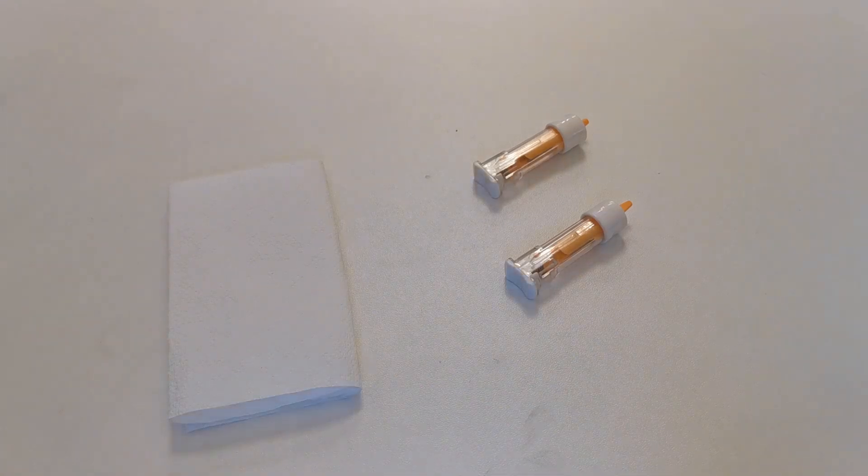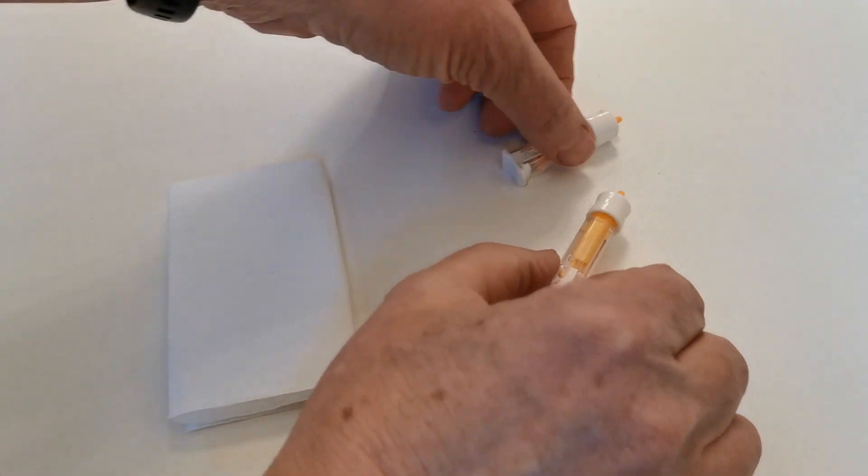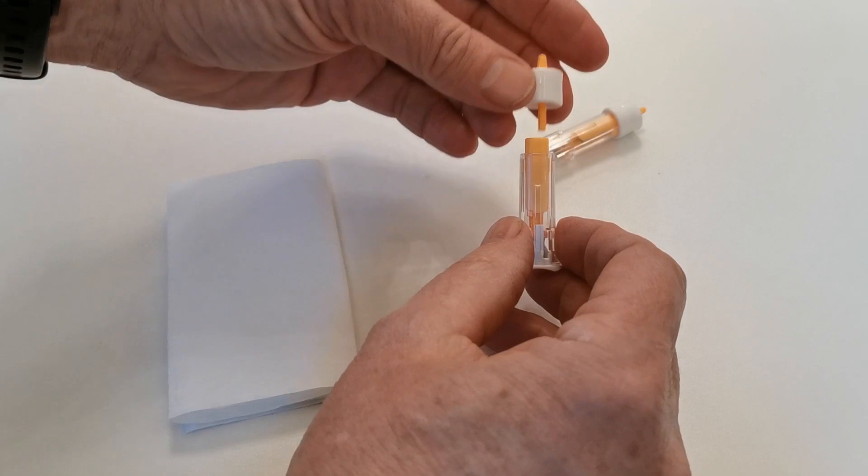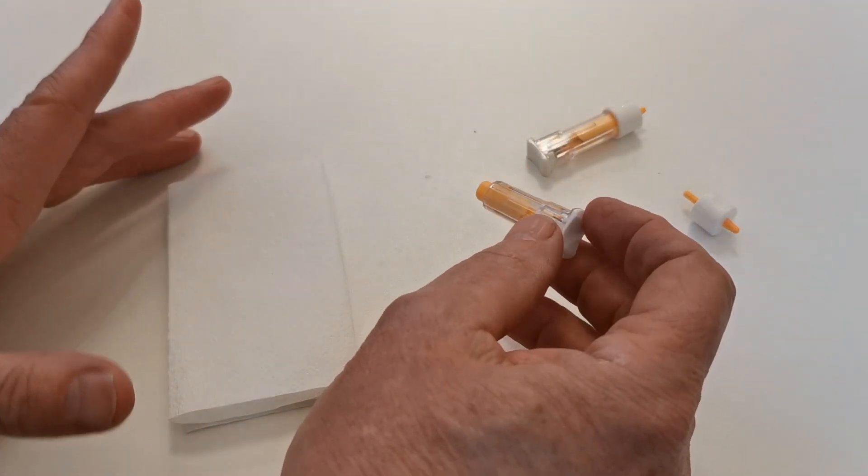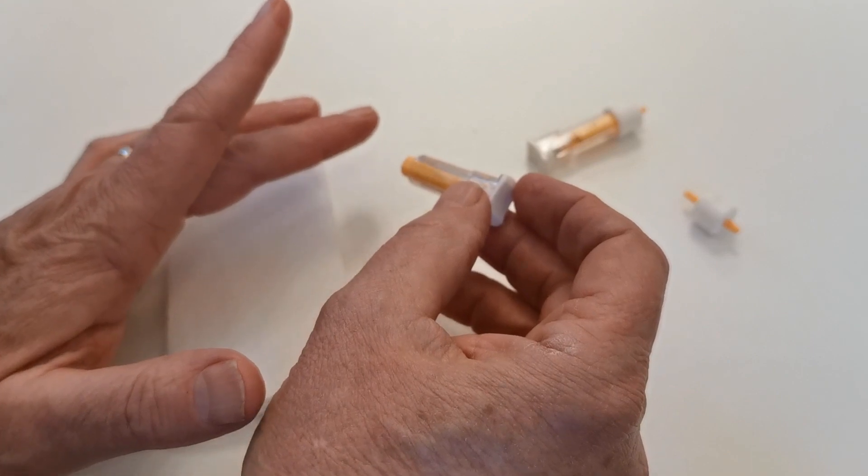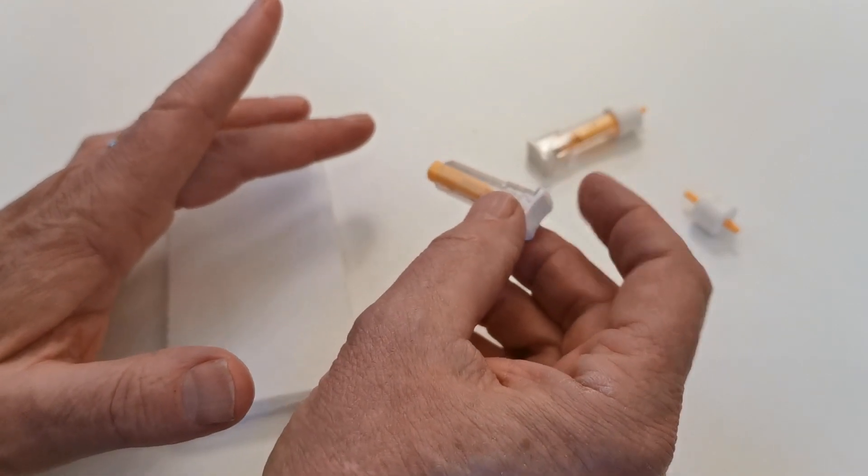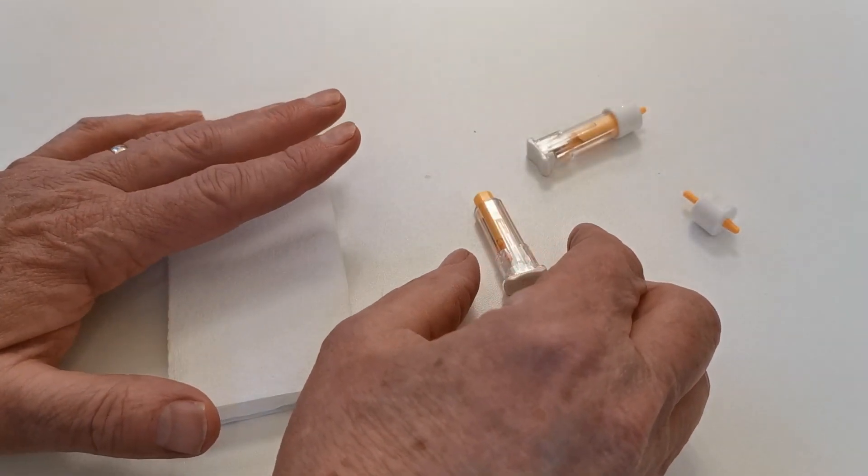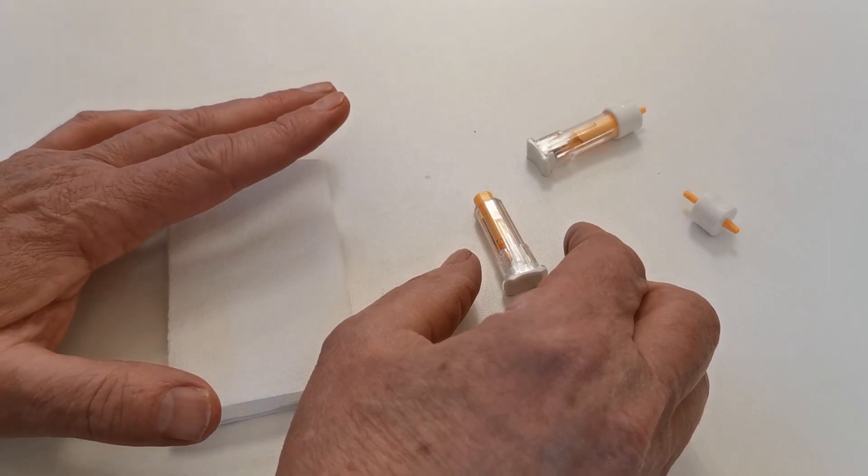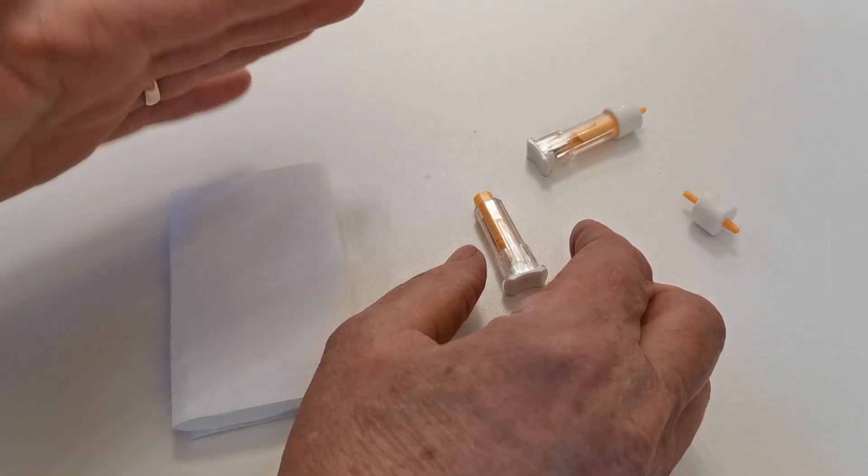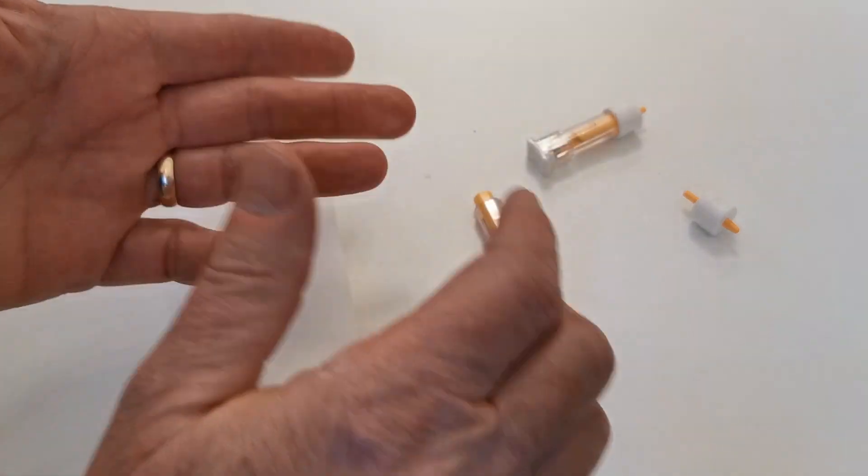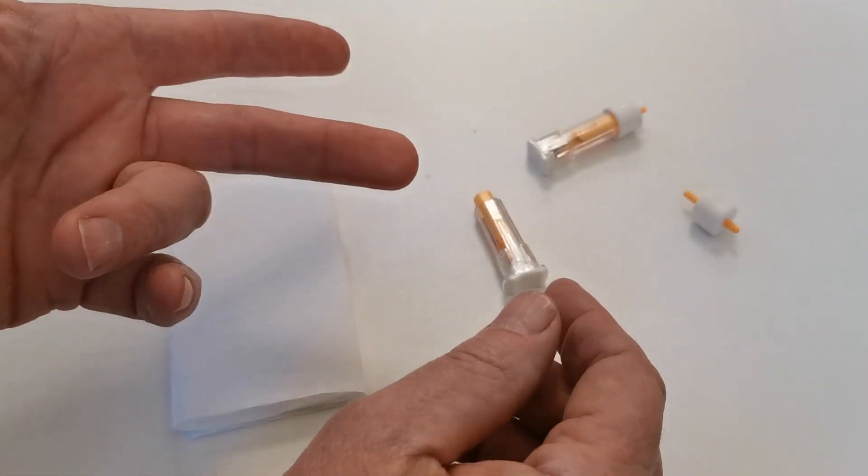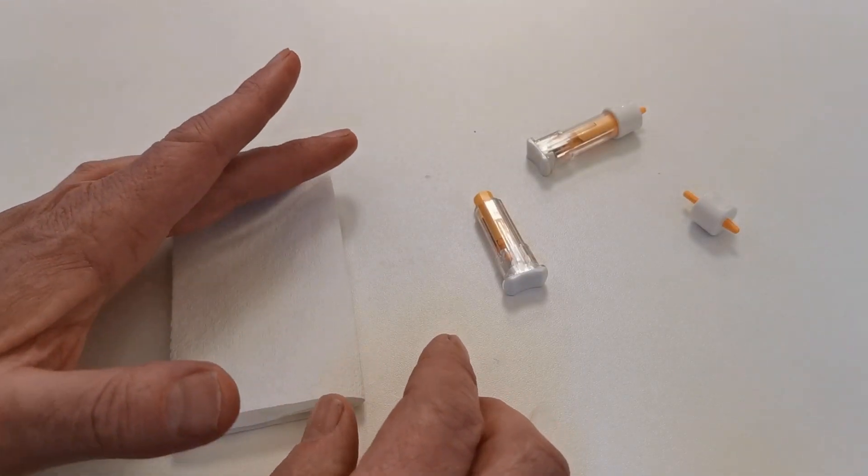Safety lancets come in a variety of different designs. These are typical. They'll have a cover on, which is removed, and then all you have to do to trigger these is to place them where you want to lance the finger and push down on the tip. Before you do that, it's important that you've washed your hands thoroughly and allowed them to completely dry. You also need to be in a nice warm environment so that you've got good capillary flushing and perfusion of your finger that you're about to stab.